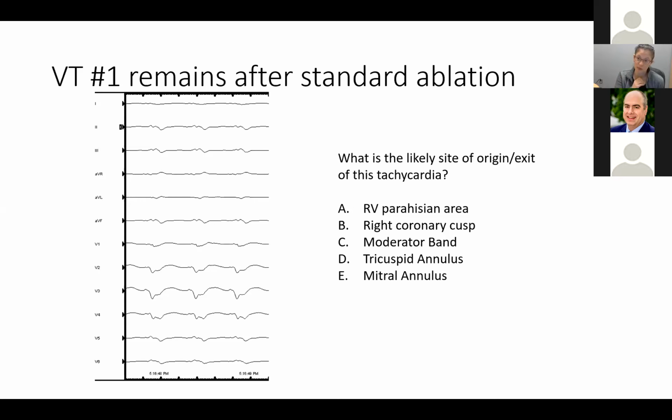So for my recent cases, I've probably done between 5 and 7 needle deployments because we know more where we need to go for the catheters. But in our early cases, especially the ones with very, very extensive disease, we did a large number of deployments. We haven't seen any complications just related to the needle deployment itself.